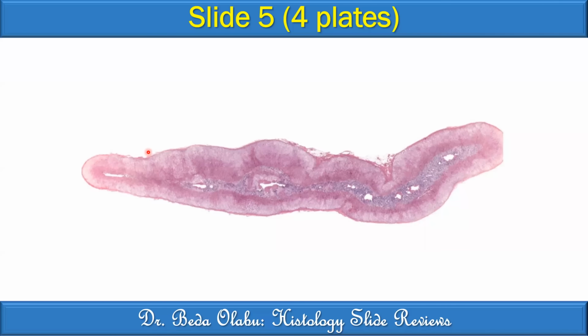All right. So in this magnification, I can say there's a layer of connective tissue around, like, the slide. But then also from far, you can see there are levels of cells, I think, due to the staining. So there are different levels of staining. Okay, good. I think you can go to the next one.